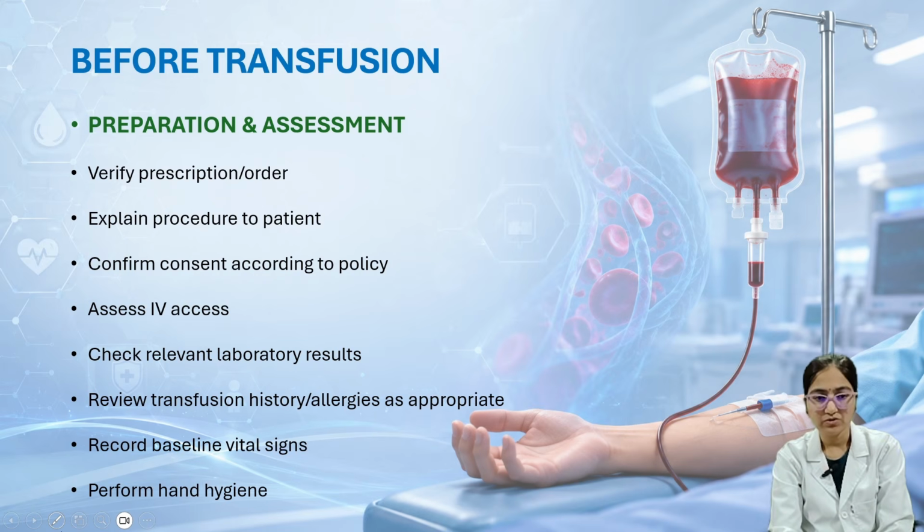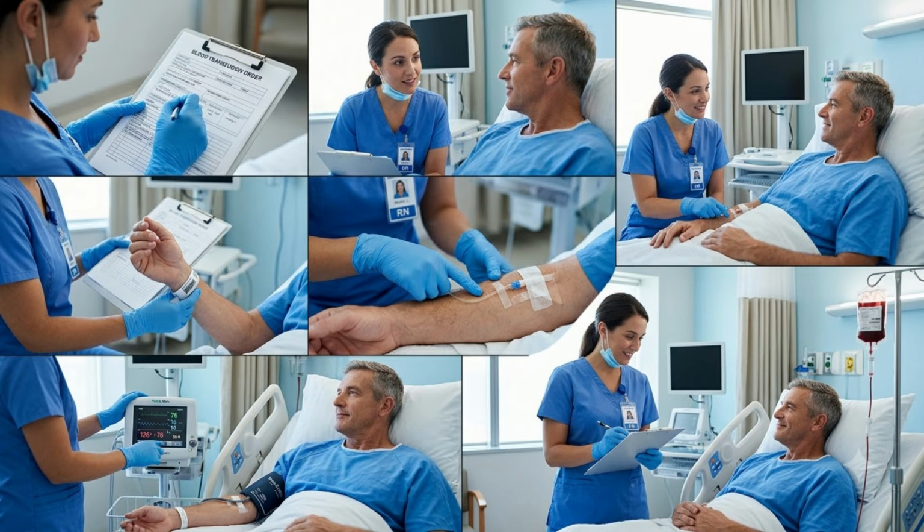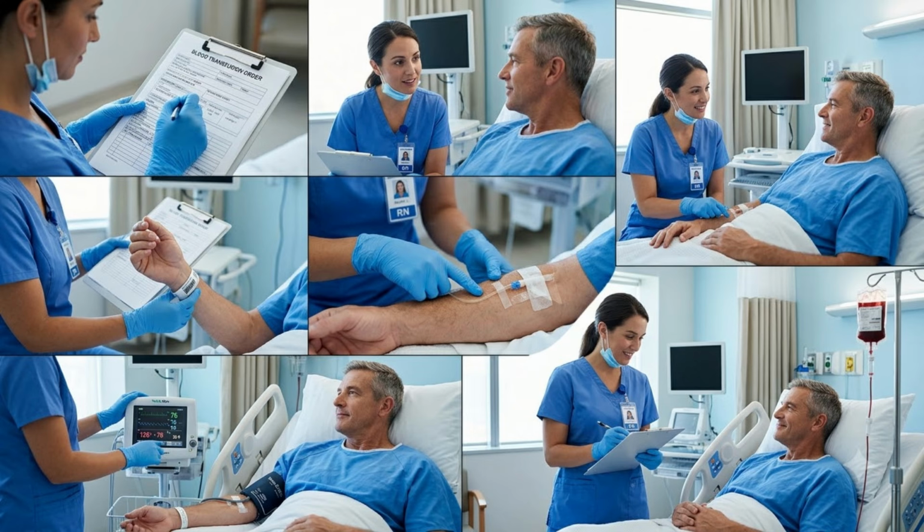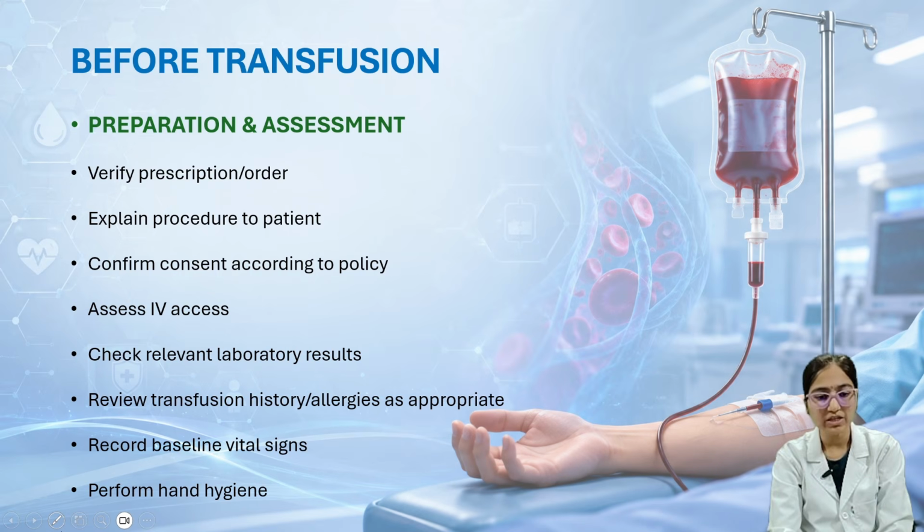Before transfusion, preparation and assessment is very important. Verify prescription or order. Explain procedure to patient. Confirm consent according to policy. Assess IV access. Check relevant laboratory results. And then review transfusion history or allergies as appropriate. Record baseline vital signs and then perform hand hygiene.